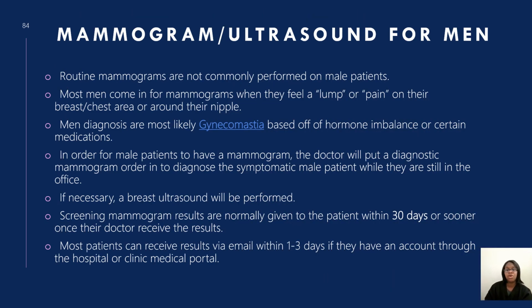Whenever we do perform a mammogram on male patients, it's done exactly how we would do it for women patients. They are in the same position. They tolerate the same amount of squeeze, if not sometimes less or sometimes more. But it is done like how we do women's mammogram images.